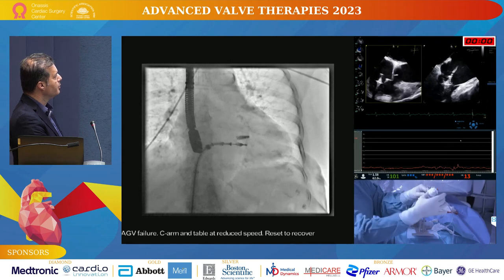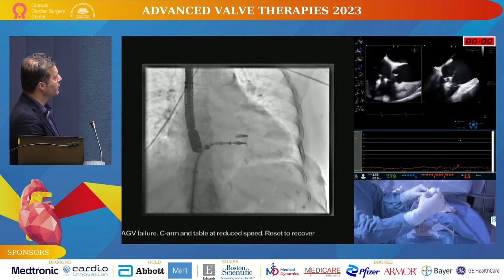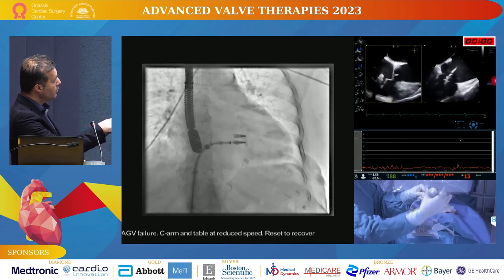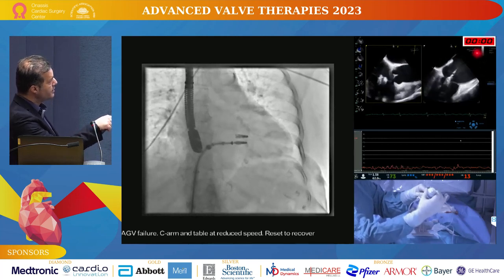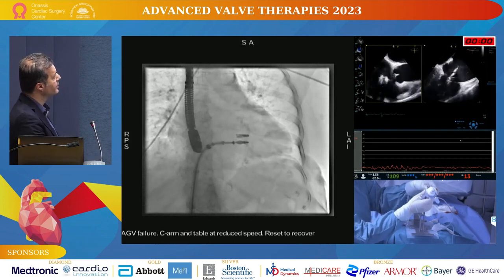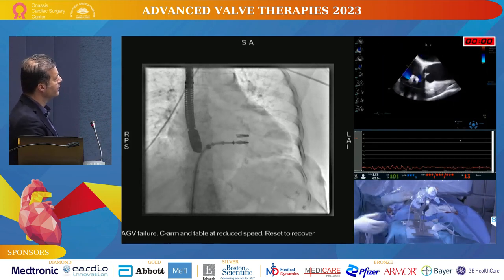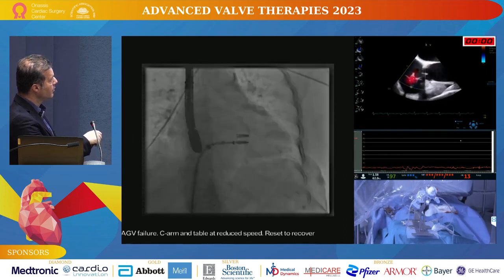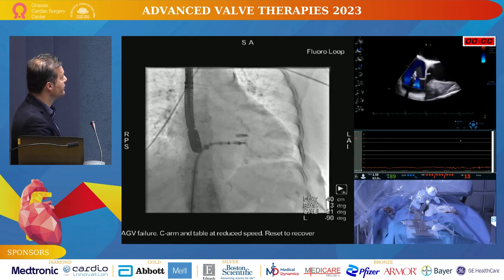We need to make sure when we close it we don't have tension on the leaflet, so we push in the handle, we correct the clockwise counterclockwise rotation, and look now what is happening to the right atrium. There's dense smoke. That is an indication that the tricuspid regurgitation has been taken care of, and this is the immediate color that you can see. Now we have practically trace of TR.